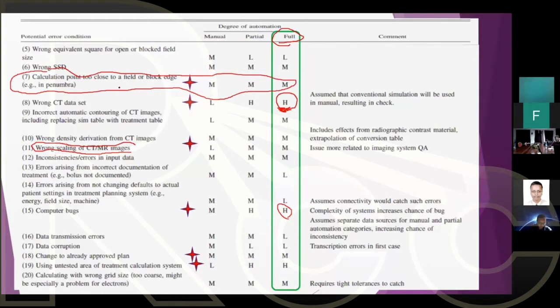And if the planner forgets about it, or doesn't realize they have it in the wrong position, and again, it happens, it's happening currently where I work, most of the time, as I said, with breast cases, because they're very challenging, especially if they are chest wall. You have to really use your good imagination to find a good location for that prescription point. If the chest wall was literally skin over bone, where would you put it?